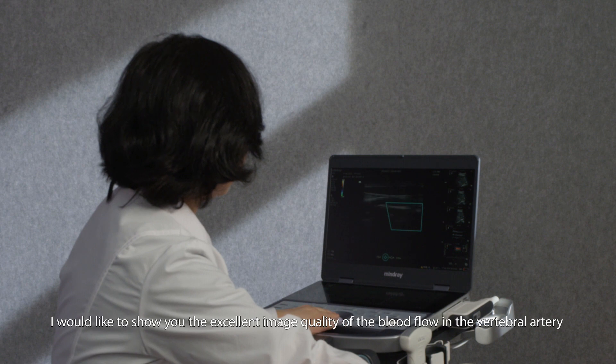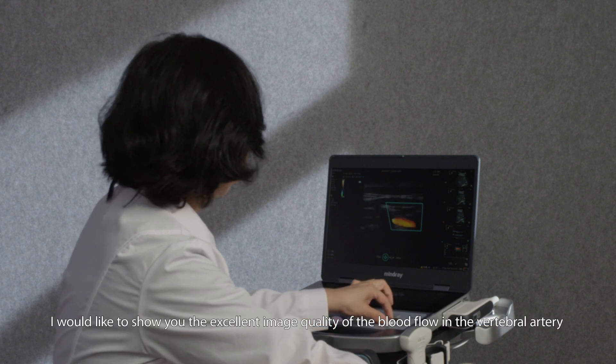We would also like to show you the excellent image quality of the blood flow in the vertebral artery.